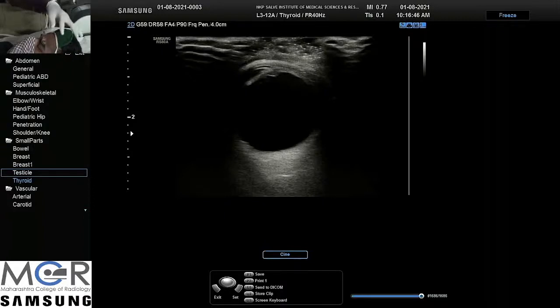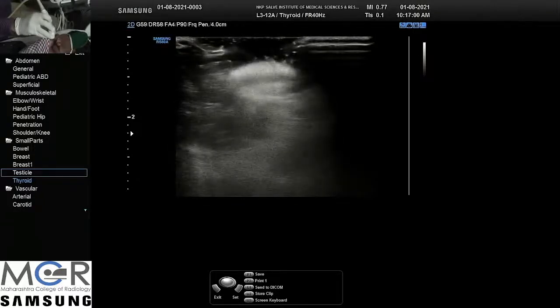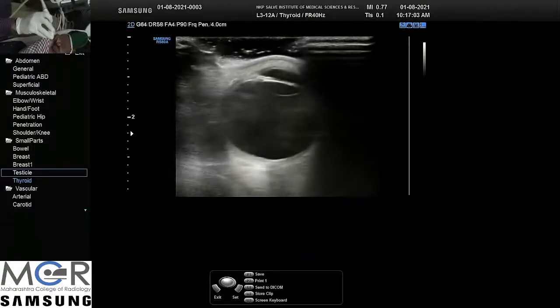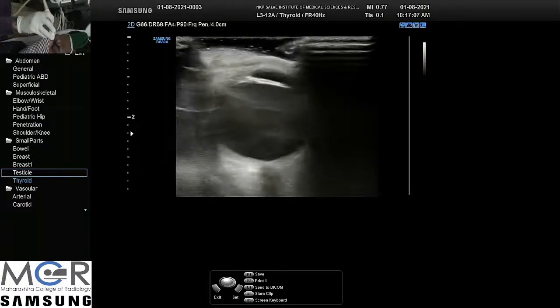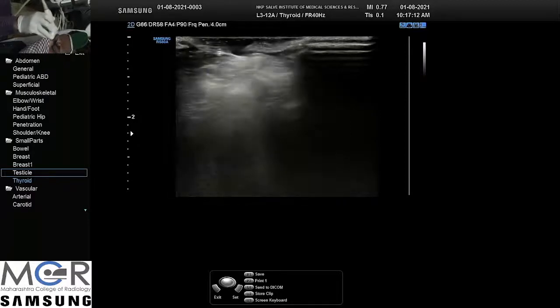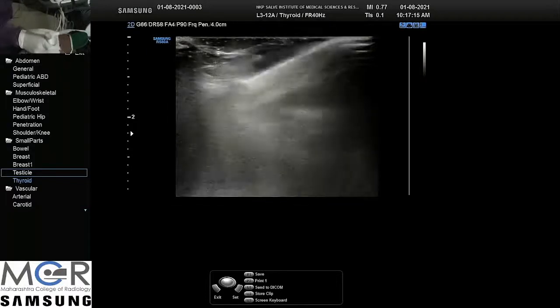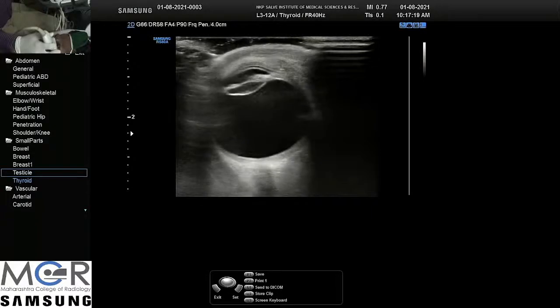You can see in the video this left eyelid is quite swollen. So there is definite injury and inflammation in the left eye. I will just see the right eye first. It is always useful to see both sides. Bilateral evaluation is many times useful for us. So we scan quickly if any problem or any pathology is there on the right side, though the patient has a significant history of trauma on the left side. So now we come to the left side.